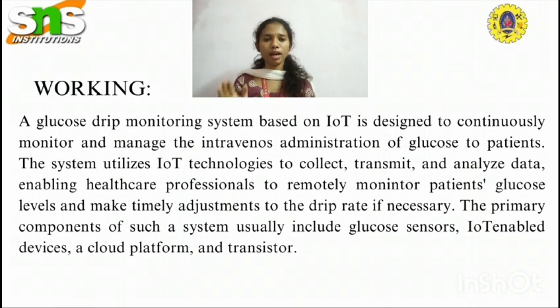The load sensor is fixed on the glucose bottle, and it continuously monitors the saline level in the glucose bottle. The information is transmitted to another sensor using the transmitter, and that sensor sends an SMS to the required nurses when it reaches the critical point.